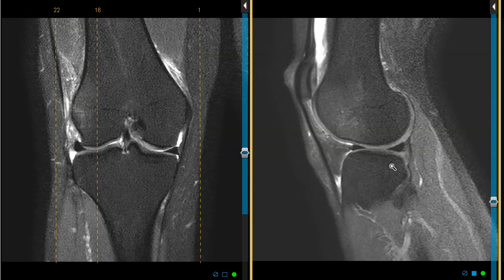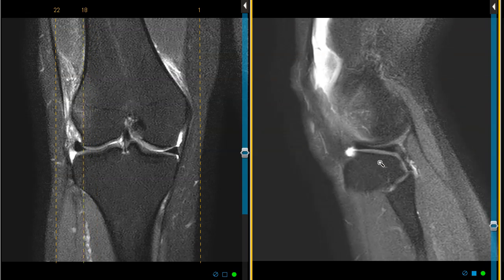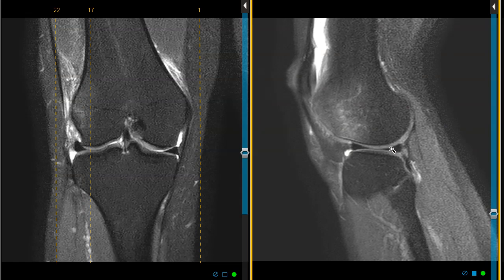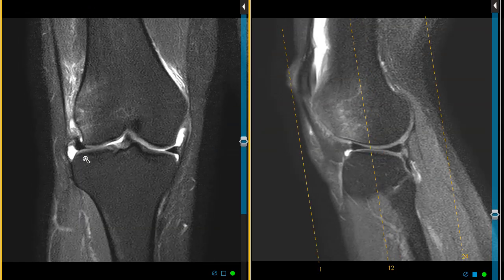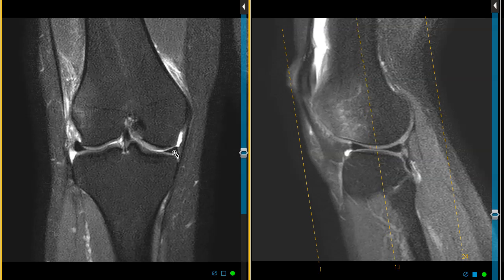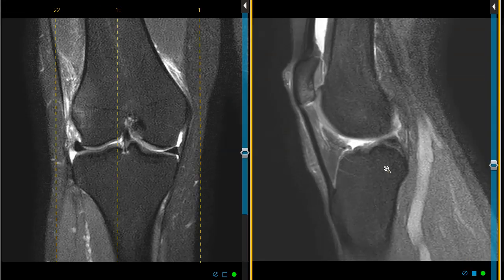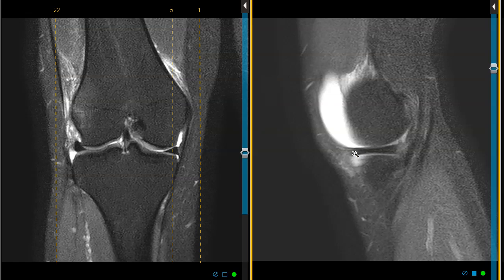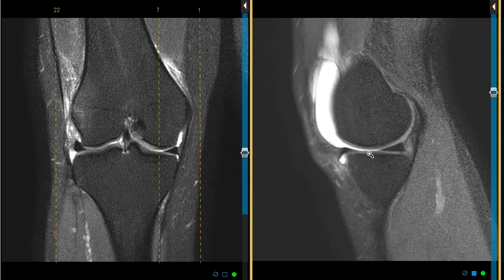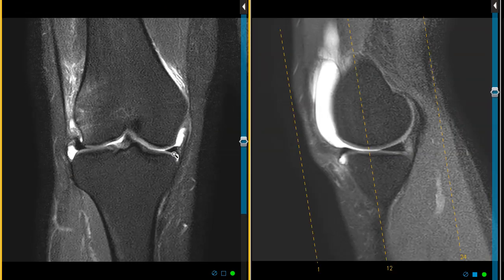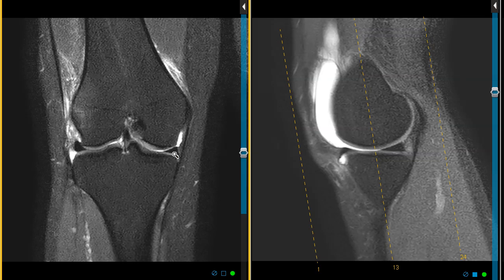If we get to the lateral side of her joint, we see this dark band — this is her lateral meniscus, which is over here. The lateral meniscus looks completely normal. This is her medial meniscus, this little black wedge. Medial meniscus looks normal in the front, back, and side, so no meniscus tear.